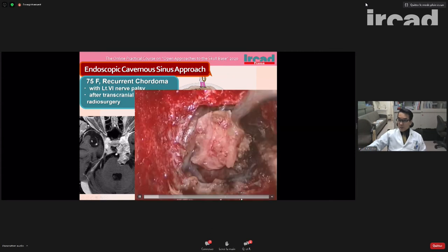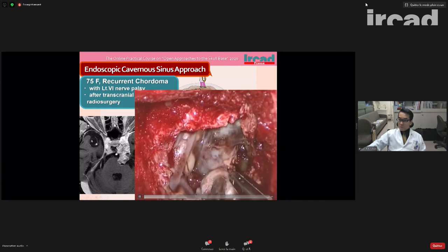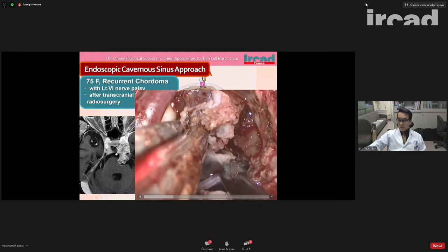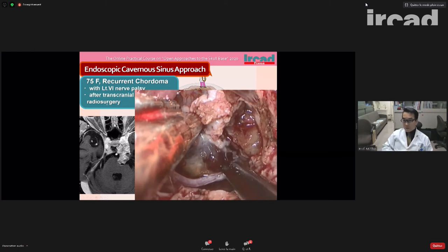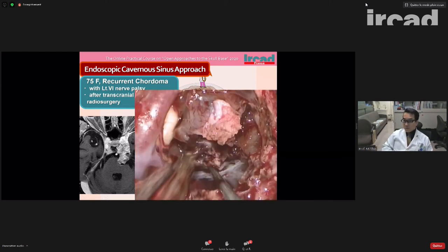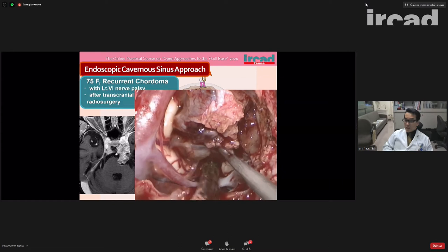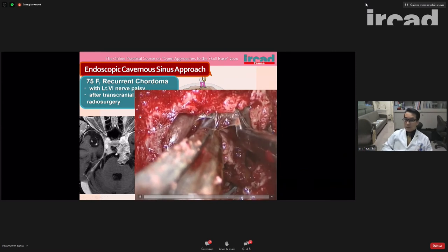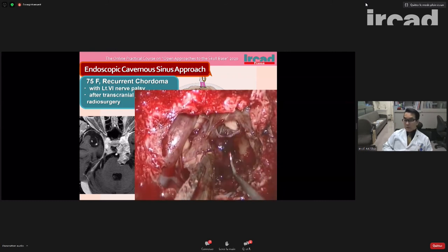So we open the dura mater and start dissection. Continue dissection of the tumor, and remove the tumor piece by piece. And this is the recurrent tumor, and it's strongly adherent to the arachnoid, but usually the recurrent chordoma is strongly adherent to the arachnoid and the pia mater. In this case, the sixth nerve is involved, but her sixth nerve function is already lost for long years.